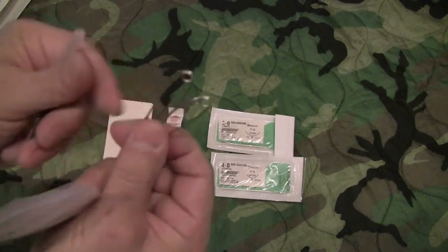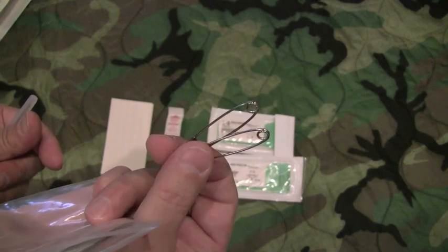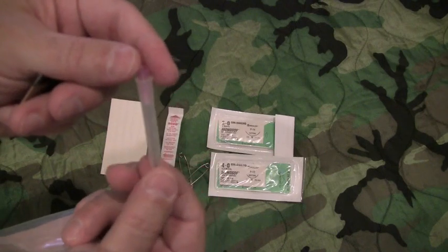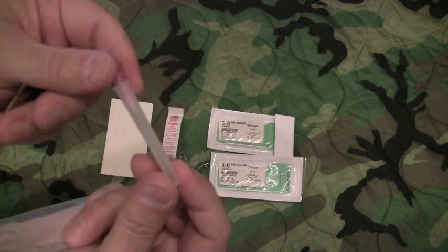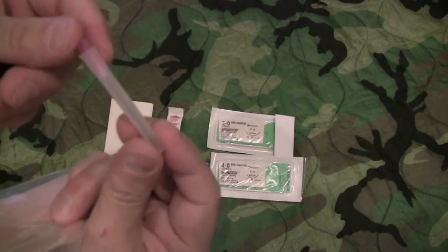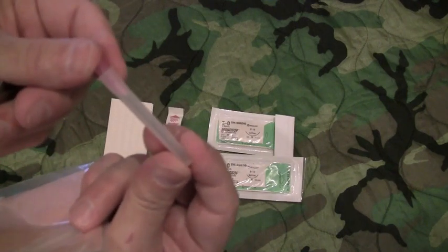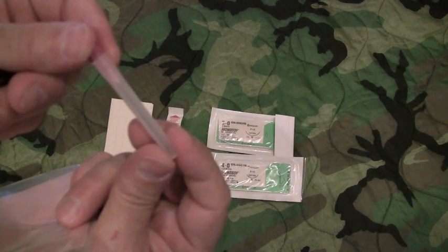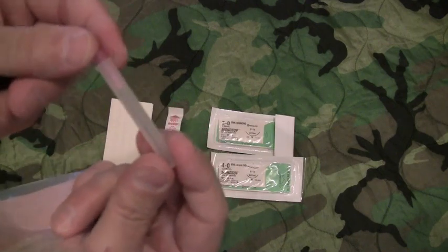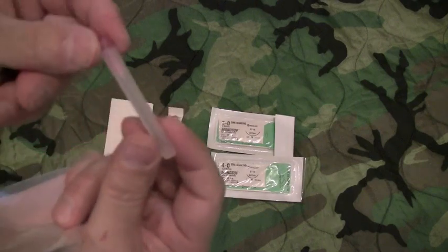Two safety pins. These are good for helping remove splinters as well as putting together a sling if you need to from a large bandana. 18 gauge needle. You can get this at a major medical supply house or at a veterinary supply or a farm supply that carries veterinary supplies. This needle is not used to inject anything. You're going to use this as a narrow bore to do pressure irrigation with the syringe. You're not going to go into the wound. You're just going to use it as a fire hydrant, if you will. And also the tip of these is also very good to remove splinters.